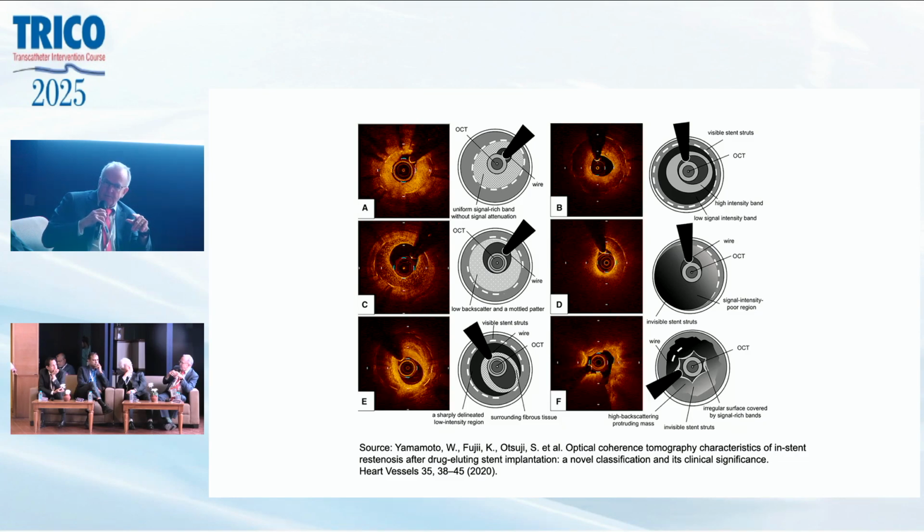And from time to time, we will show our colleagues, and particularly our fellows, angiograms showing quite significant dissections. And they were left alone. And the patient came back months and particularly years later. And sometimes there was actually no sign at all of those dissections. Some had healed, and there was some residual evidence. But of course, those were angiograms performed in the pre-stent era, and it was just to show the natural history. And most of these do well.